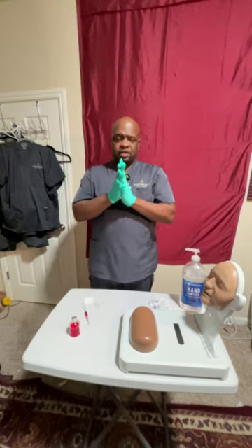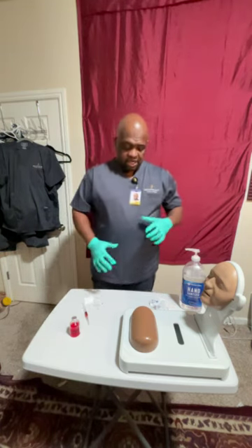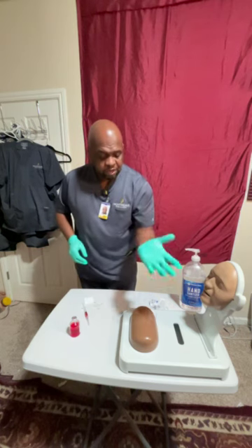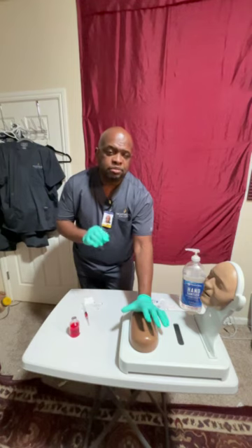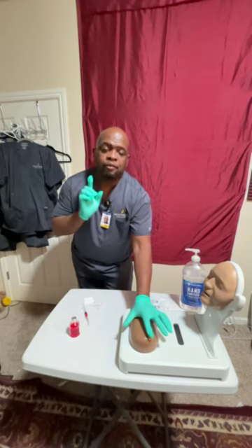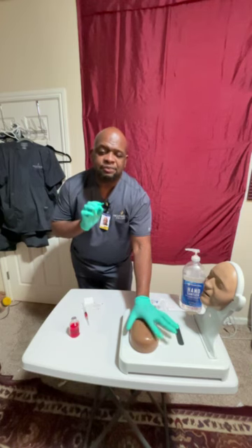So from there, I am going to have the patient turn over to his side and position the patient. I'm going to use the heel of my hand, and I'm going to press down on the greater trochanter, right? Then my thumb is going to be pointed towards the groin of the patient, and my index finger is going to be pointed towards the iliac spine, right?